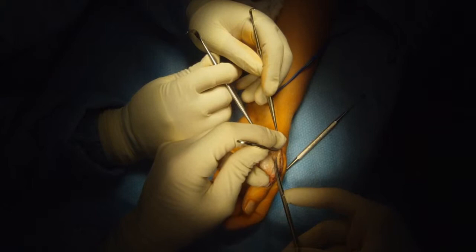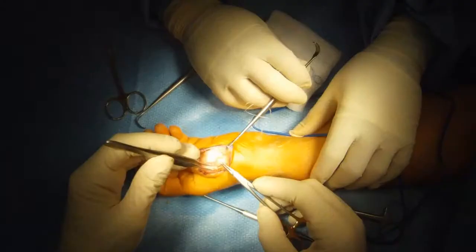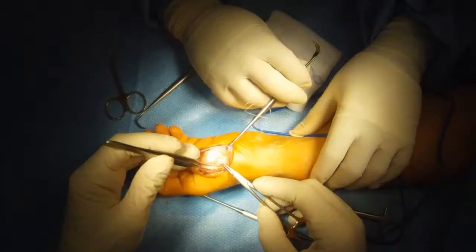I then free up the tendon from the underlying bone, remove any scar that's there, and make sure that it glides freely. Then I resuture the tendon.